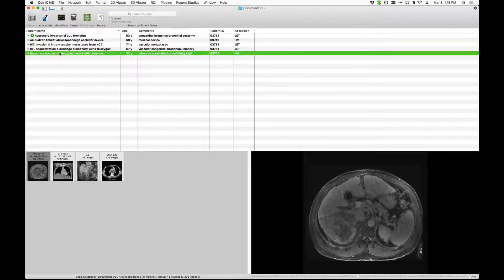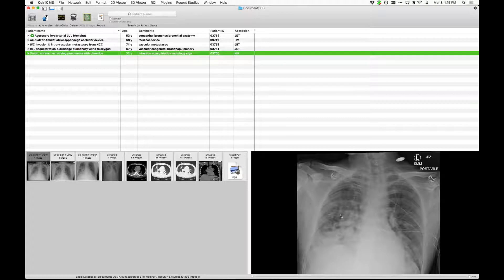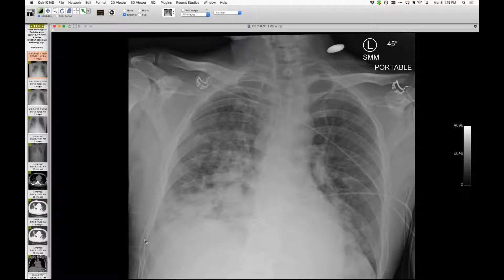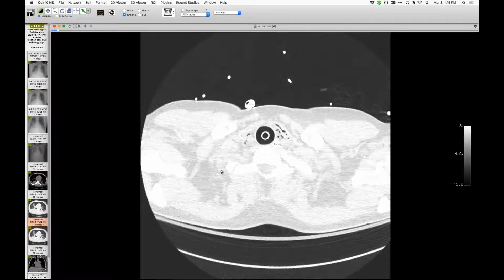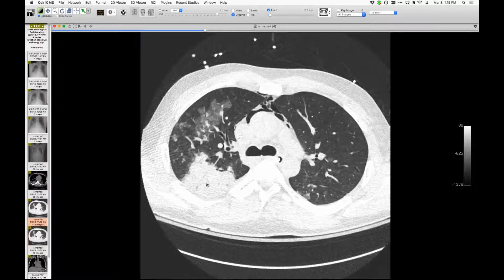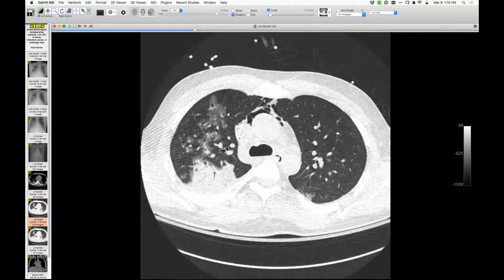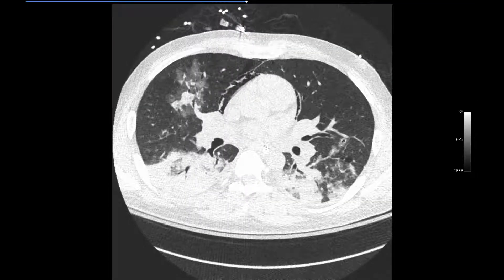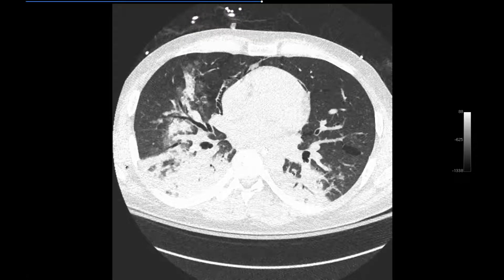I want to show one real fast. Travis will like this one. A couple of weeks ago, I showed a case of necrotizing pneumonia from a staphylococcus and I showed Cheerios. As things sometimes happen, we see cases like that in rapid succession. So here is another patient with necrotizing pneumonia — this is Staph aureus by blood culture. Let me bring up some thin cuts because in this patient too, I think I see Cheerios. Let me find a couple of Cheerios for you — like here. I think I found two, maybe two or three little Cheerios, little areas of necrosis making Cheerios in this patient with necrotizing pneumonia.